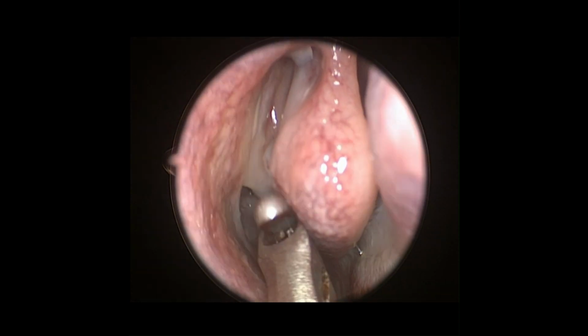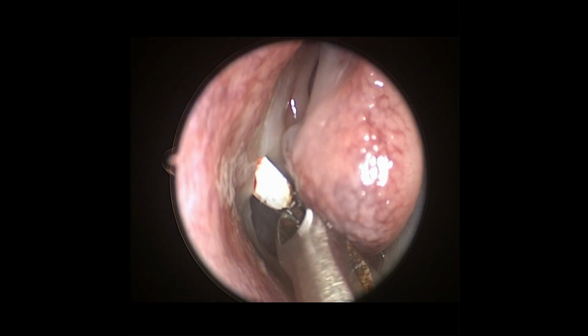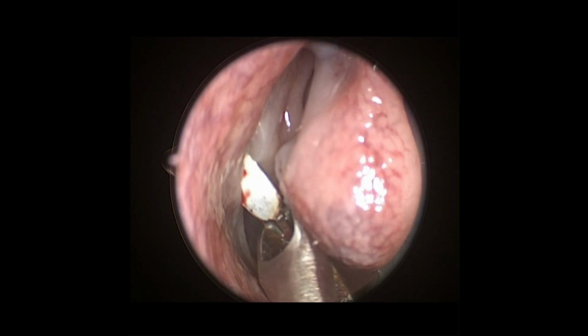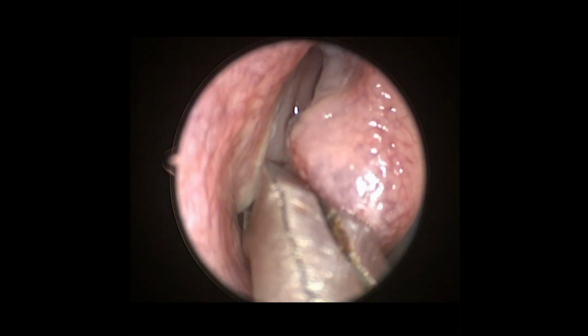The same steps are followed on the right side. Number 1 is removal of the uncinate vertical segment.